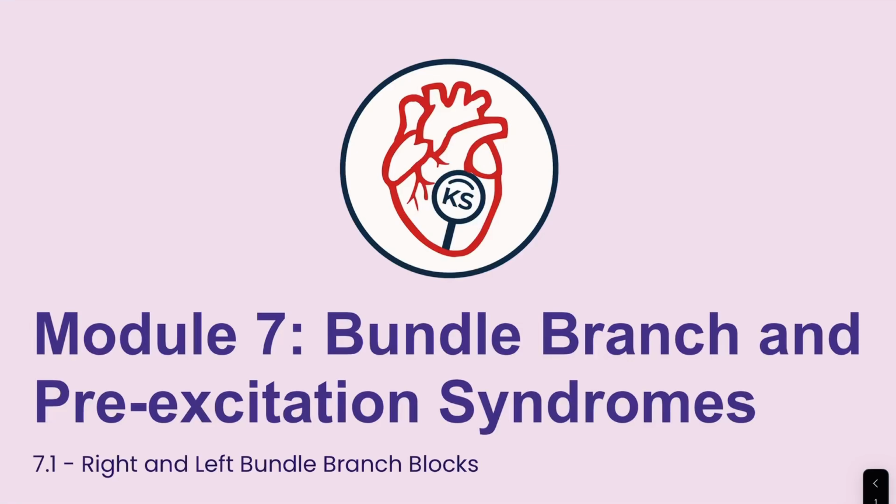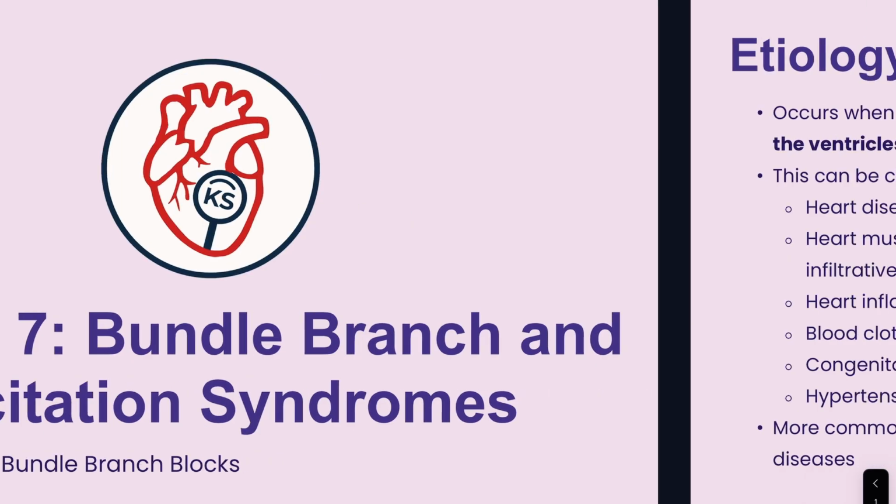Welcome back to our EKG module series. We're going into module 7, bundle branch and pre-excitation syndromes. Let's start off with our bundle branch block.